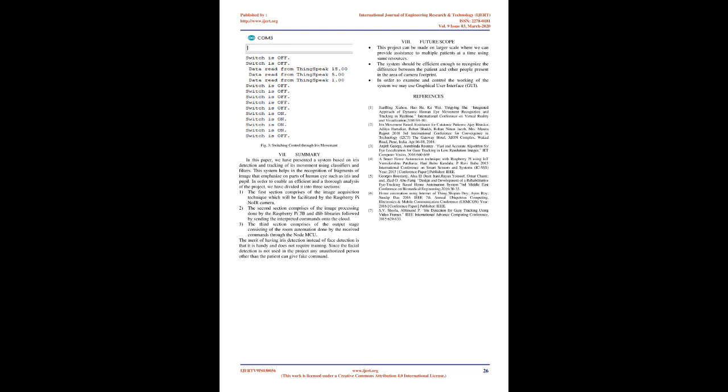3. The third section comprises the output stage consisting of the room automation done by the received commands through the node MCU. The merit of having iris detection instead of face detection is that it is handy and does not require training. Since the facial detection is not used in the project, any unauthorized person other than the patient can give fake commands.